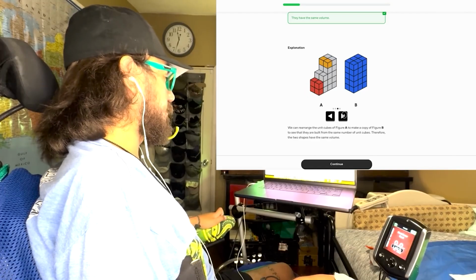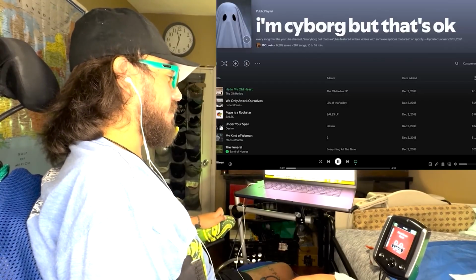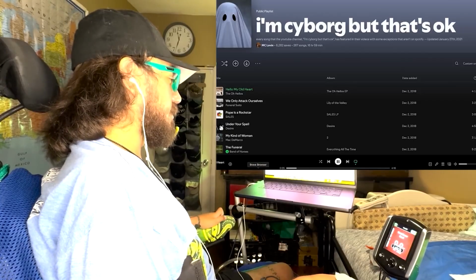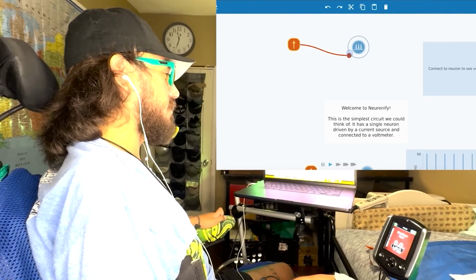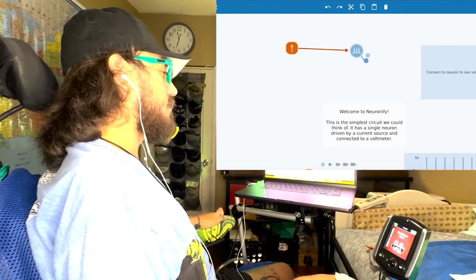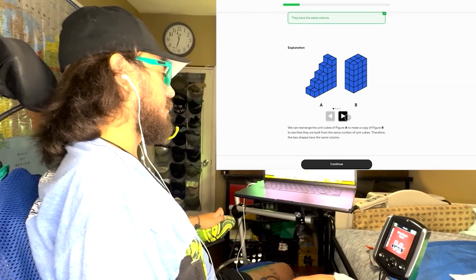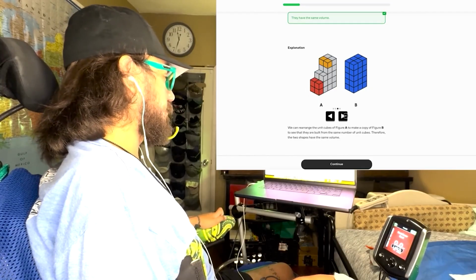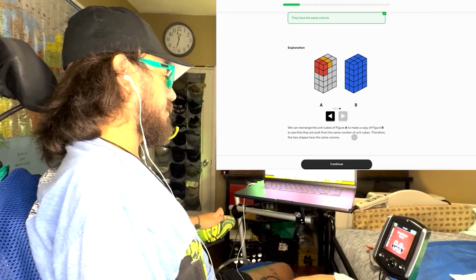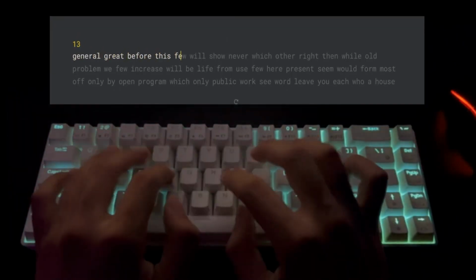They also mapped left and right mouse clicks. See, it's all like using a mouse. Except the mouse is unnecessary. The mouse is just a middleman. Actually, our hands are also middlemen. Try thinking broader, and you'll realize that the two endpoints in interacting with a computer or phone are us and the device. And when we want to communicate or interact with the phone, we use middlemen, our hands, or even a second middleman, a keyboard or touch screen.